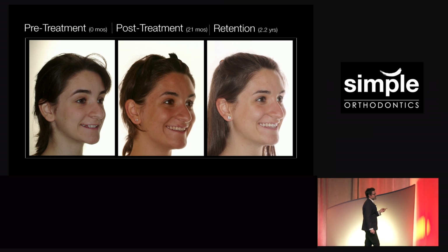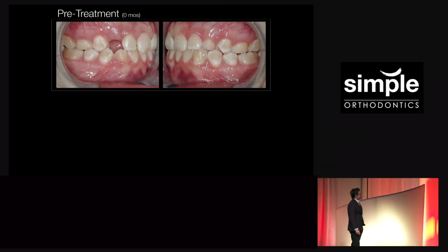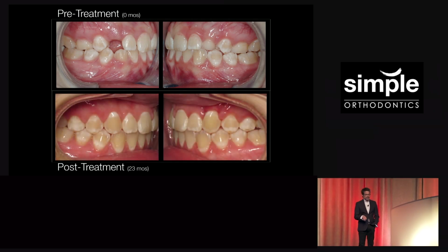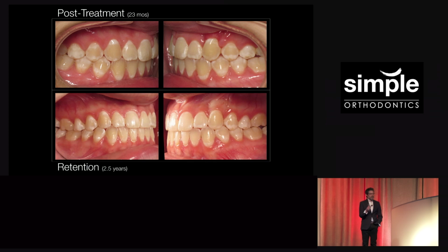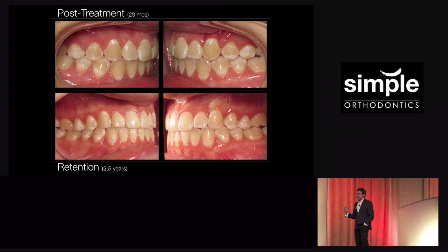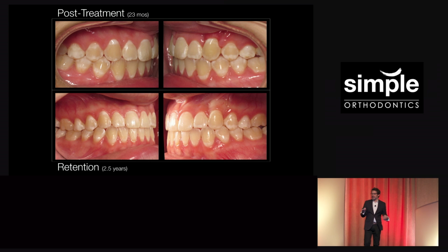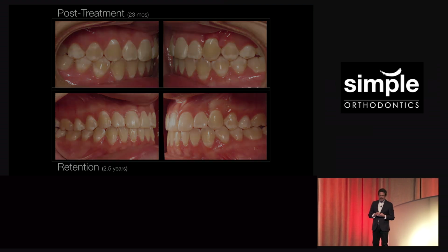So here's what Jessie looks like almost 2.5 years after ortho. Here's her end of treatment. This is a couple of days after a connective tissue graft on that canine. Here's what she looks like at 2 years follow-up. Nighttime Hawleys only, that's it. So when cases hold up, I think I want to repeat that. I want to do that again and again. And when they fail, I want to get in and study and figure out, well, what did I do? What did I miss? What's that little thing that I'm not getting? And I think that's how we learn.